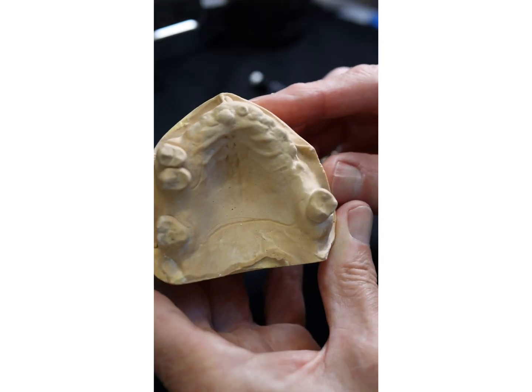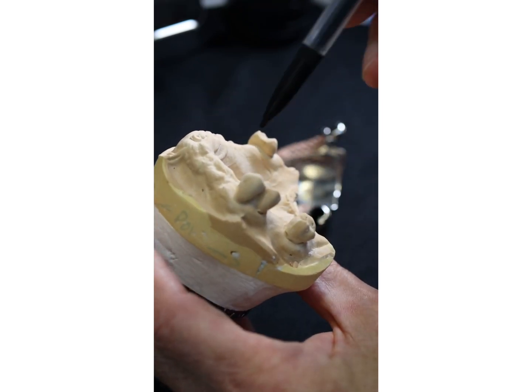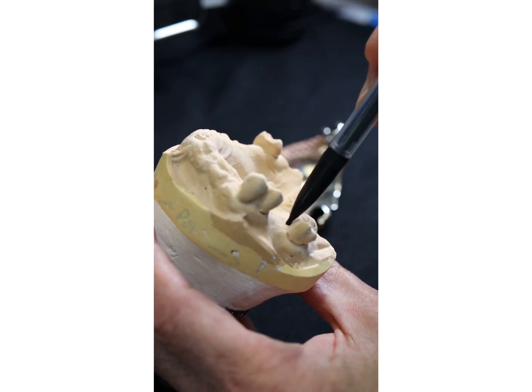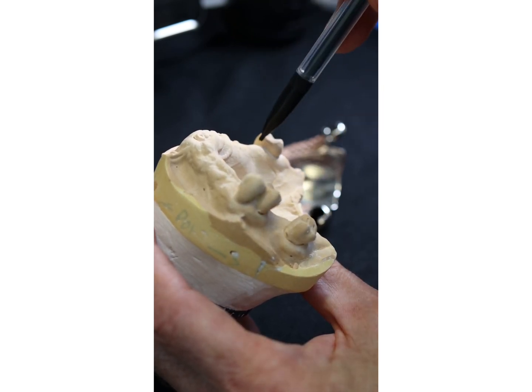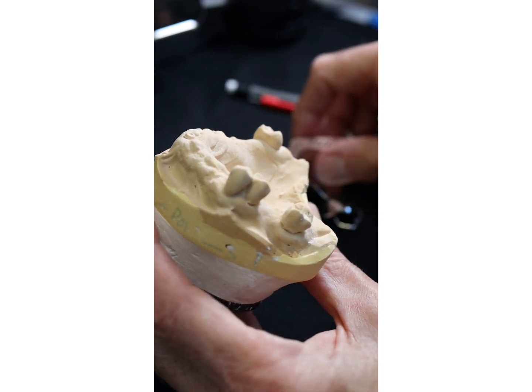So we'll now show you how this works. We surveyed the cast and created a guide surface there, or a guide surface existed. It's parallel to this surface here and this surface here, so we've got three parallel surfaces — that's going to aid retention.